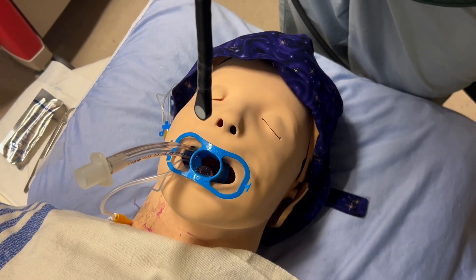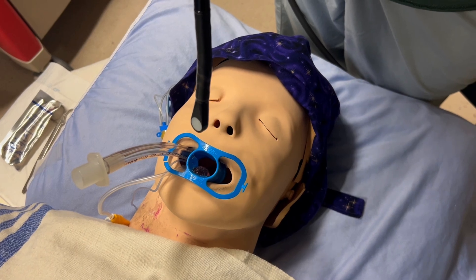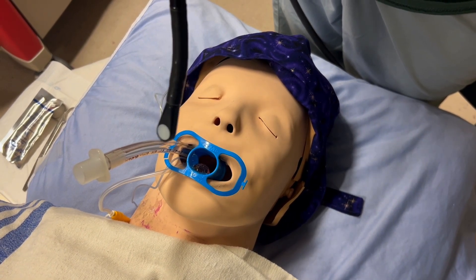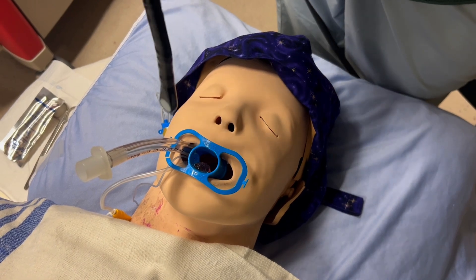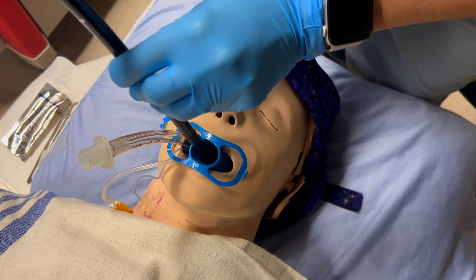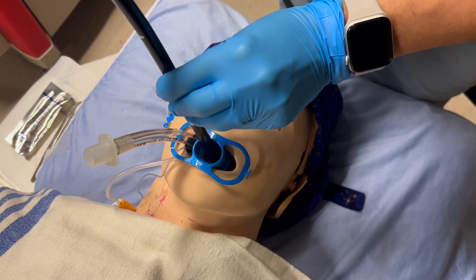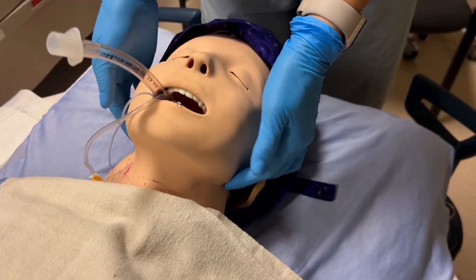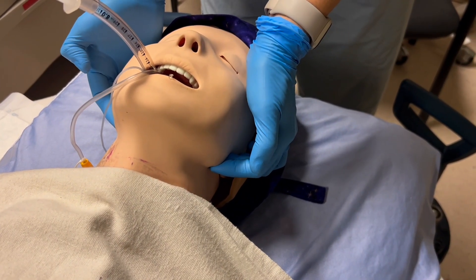Start by inserting the transesophageal echo probe in a neutral manner. However, as it gets towards the back of the throat, slight antiflexion may be needed to help guide the head of the probe into the esophagus. Please be careful and only use gentle movements and avoid putting excess pressure. Depending on patient anatomy, a jaw thrust may be needed to assist with intubation.